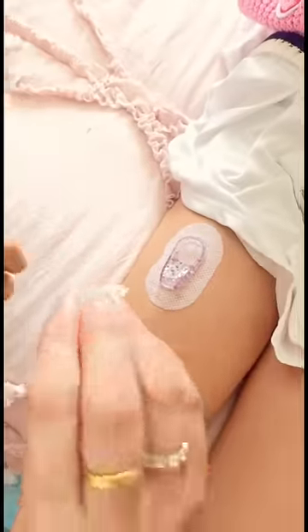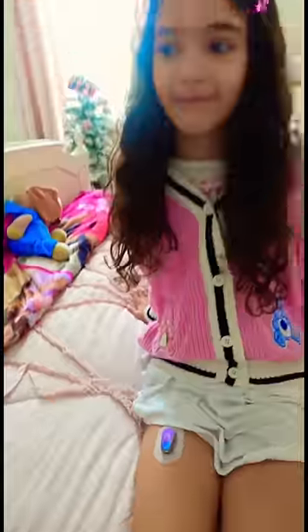Okay, it's time to put in the little transmitter. You're done.